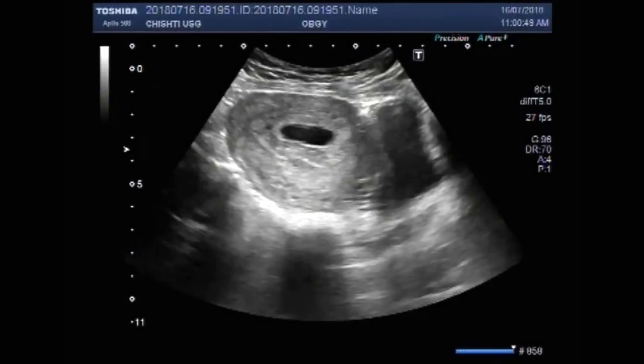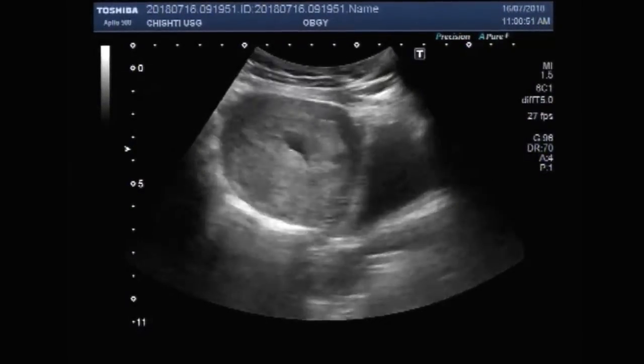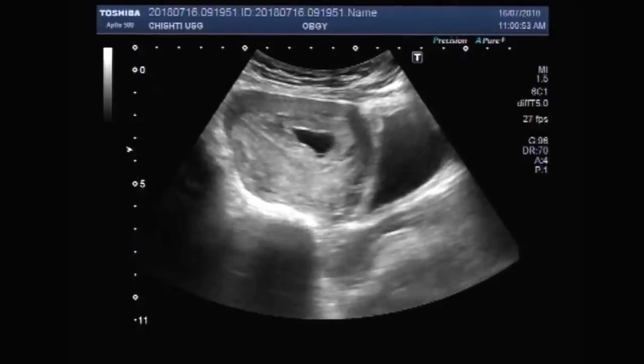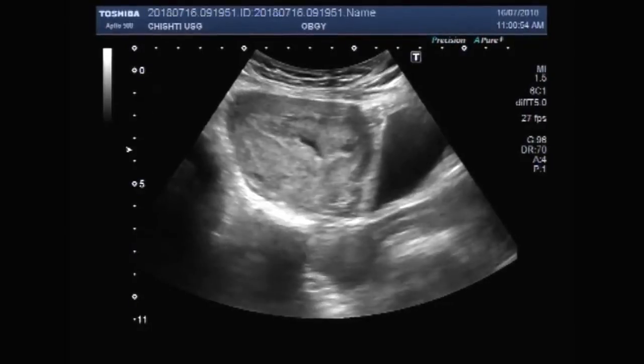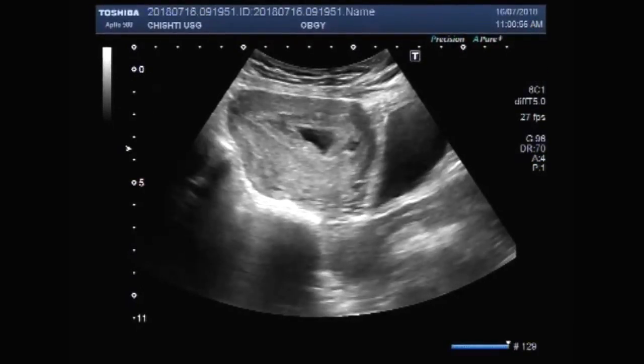Dear viewers, I hope you are all fine. This ultrasound video shows a case of blighted ovum.